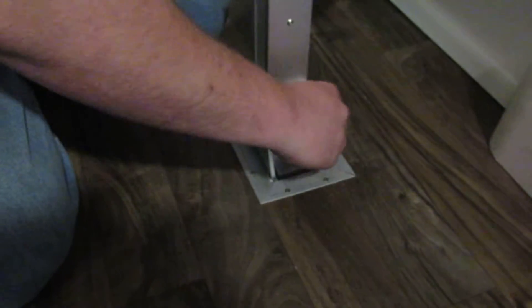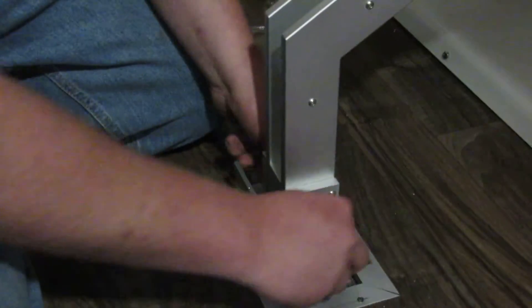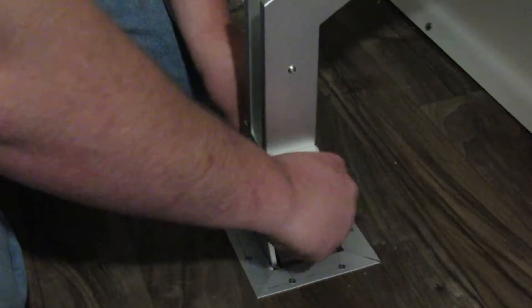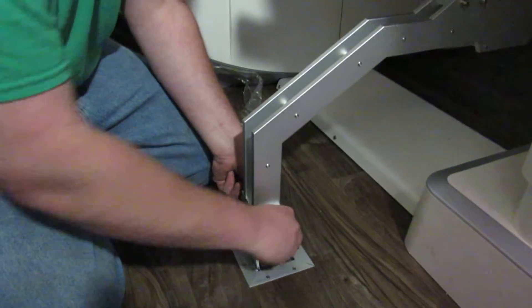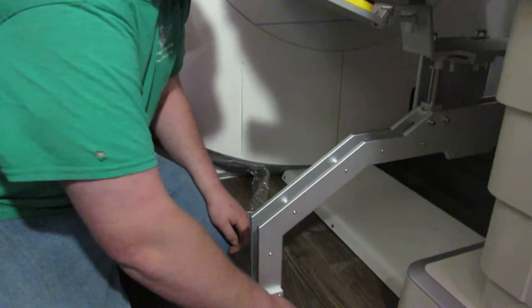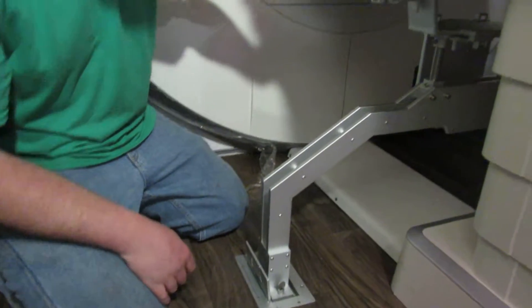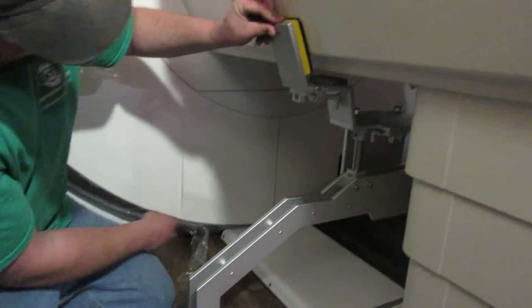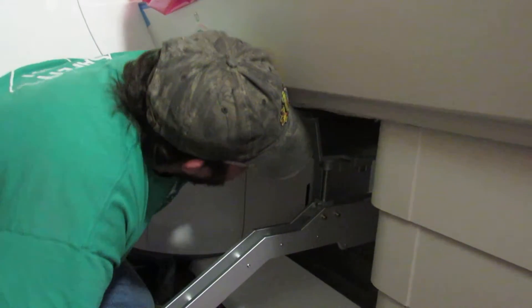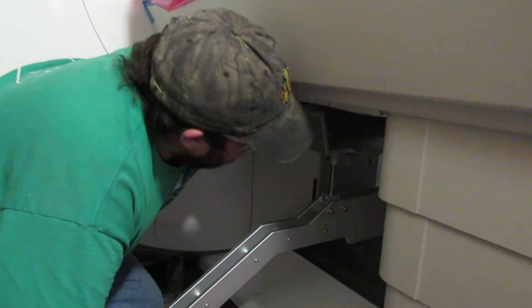Then you have the two screws, and you'll have your two holes right here. There's those thumb screws going nice and easy. You just go until nice and snug. Good to go on the screws, put that up — there's a little slider, slide it in. Same thing on the other side, and then we're good to go.